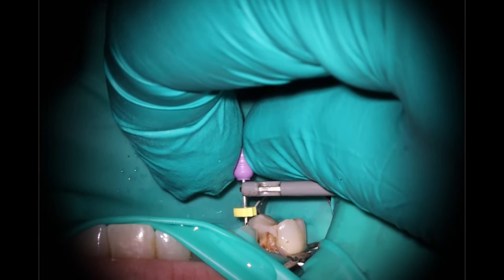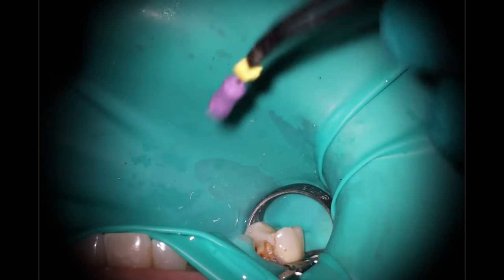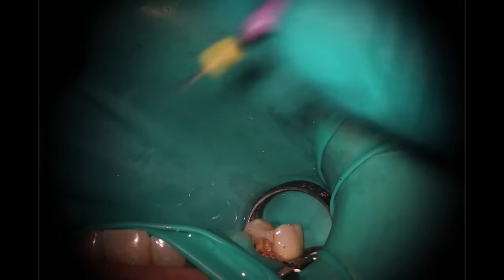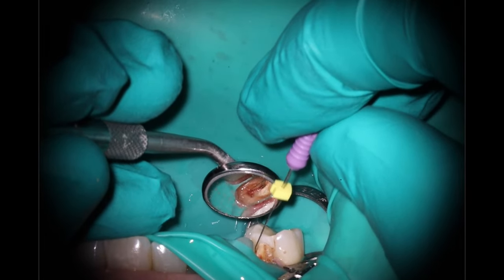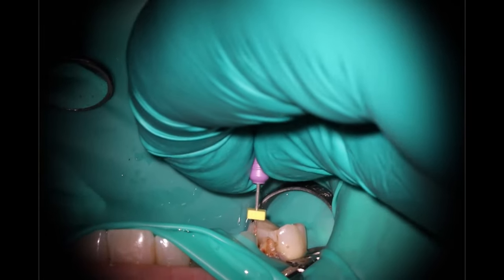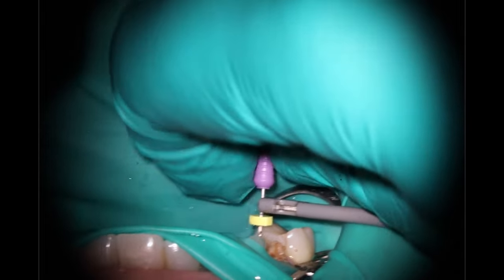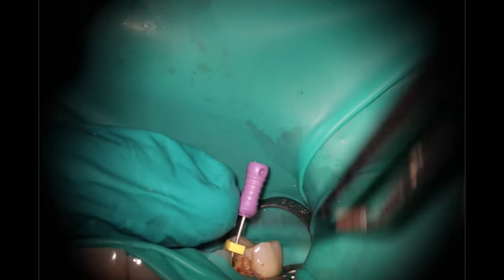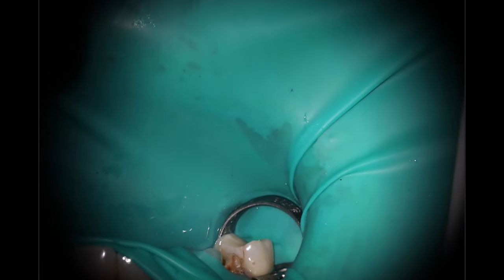Getting this length again as we go back in. The two canals — I believe they join at the apex, which is what it felt and looked like. With these type-2 canal systems, you'll find that smaller files will back themselves up a little bit. It was slightly calcified, nothing out of the ordinary. You'll see I have to go down a couple of times with rotaries where it's usually a one-and-done situation. But at this point we have our length, and you can see how that file was bent as well.